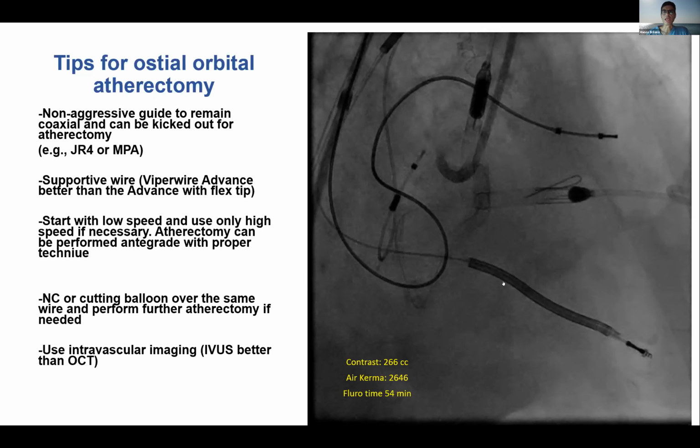Yeah, no, absolutely. And I guess the solution to this is, you call the surgeons, right? There is a point in life about calling the surgeons and going for emergency surgery, and this may be one of them. If you lost your wire, you have a major perf. Maybe there's not much that you can do for that. So this is one of the things that can be done to minimize that complication.